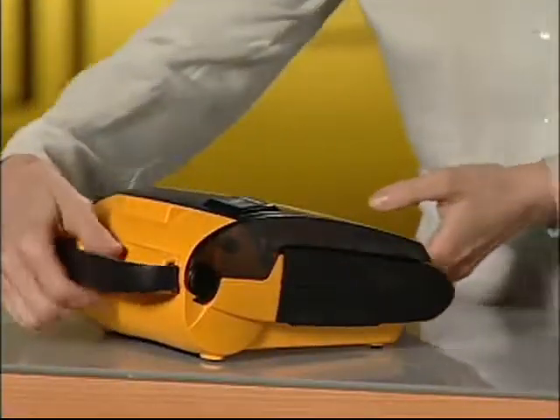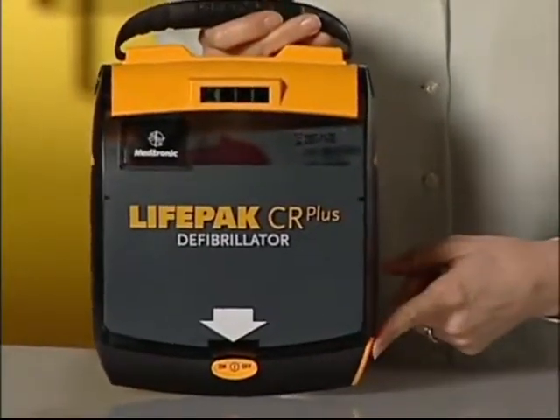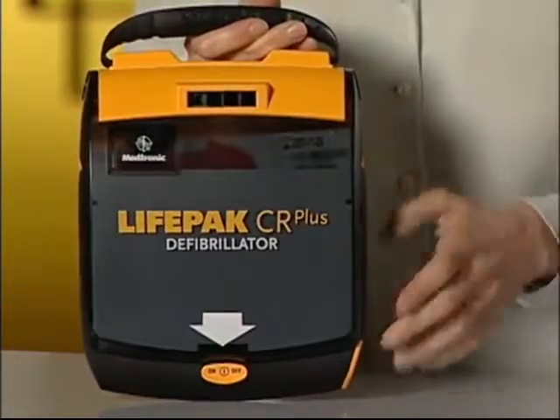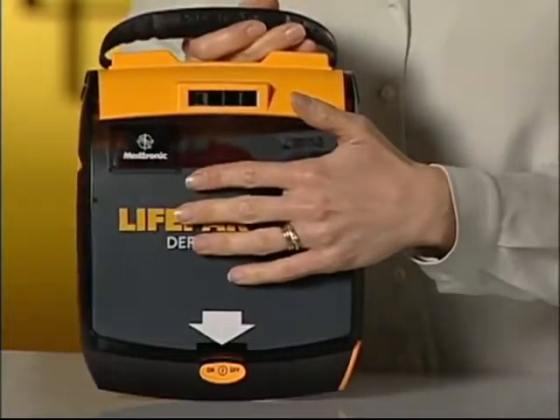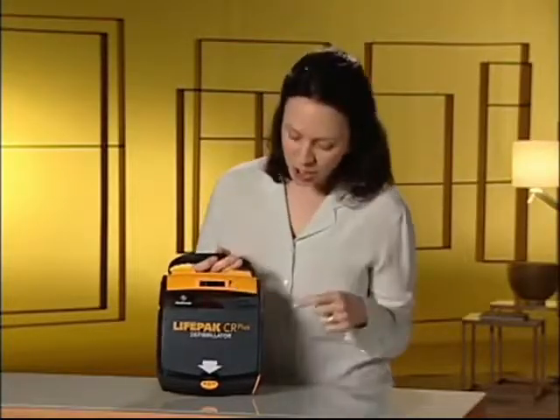The first time you unpack the Lifepak AED, you should inspect it briefly to verify that it responds appropriately and wasn't damaged in shipment. The Lifepak AED comes with the battery charge pack already charged and in place. The electrode pads are also already in place inside the lid. It's ready to use. You can tell by this OK sign right here. Check the OK sign. Check the use-by date on the electrode package. You can see it through this window.